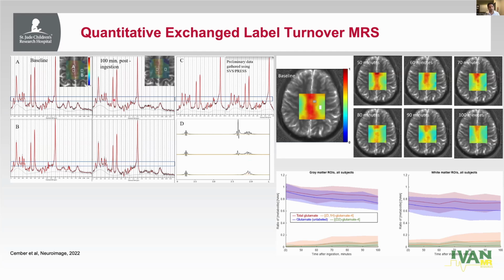So you can now, instead of subtracting the 2 spectra, because the patient will inevitably move during your scan, actually fit these spectra, adding prior information to your processing tools, like LC model, and you can come up with this nice decay curve of glutamate 4, glutamine 4, and other metabolites that you can think about getting labeled. And so you can basically draw a map showing the decay between gray and white matter, just as GLX4 after drinking glucose over time.